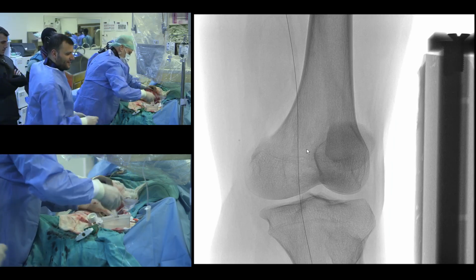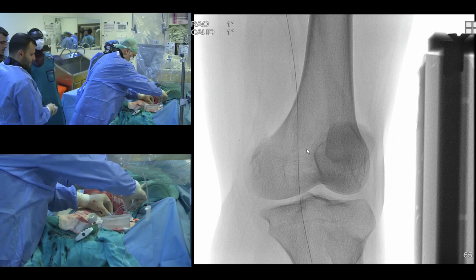Yes, after nitrate. Connect to the other. Yes, okay.